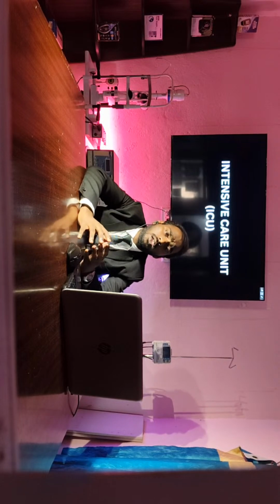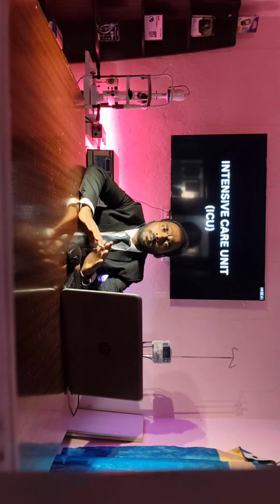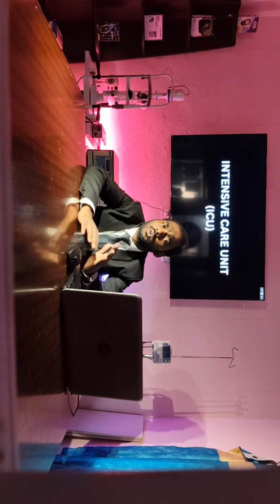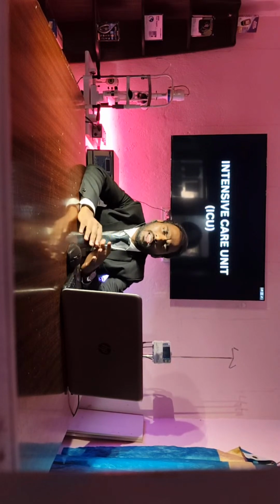Every equipment is very costly, and they follow some standards. What are the standards? They go for a routine checkup of each and every piece of equipment in the intensive care units. Some equipment in casualty units may be checked weekly or monthly, but in the ICU, they need to check each and every day whether it is working properly or not. That much protocol and those rules and regulations should be followed in the intensive care unit.